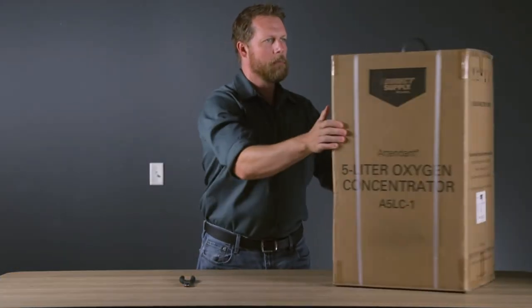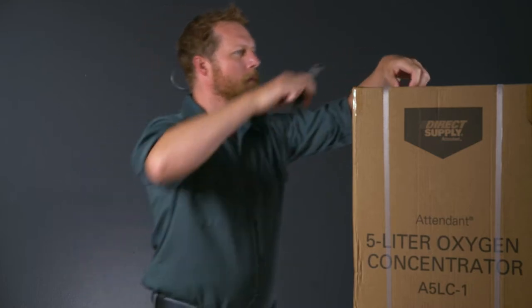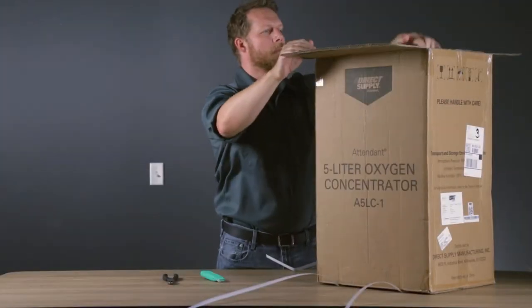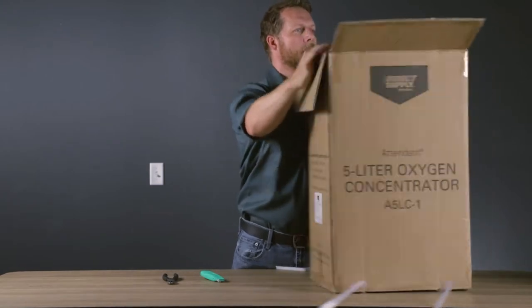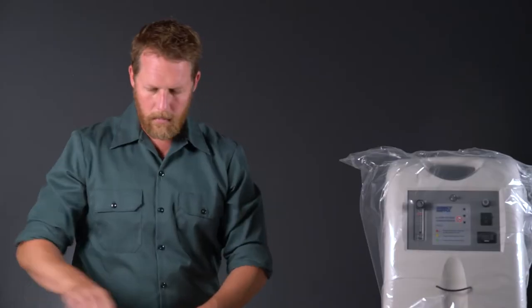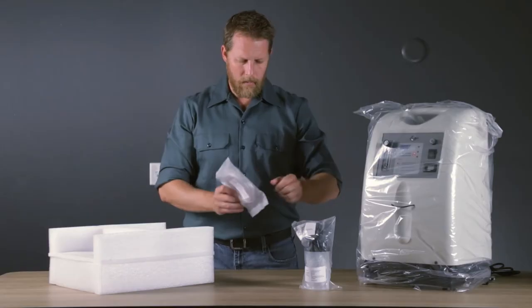When unpacking the concentrator, check for any obvious damage to the carton or its contents. If damage to the concentrator is evident, notify your Direct Supply Account Manager. Remove all loose packing from the carton, then carefully remove all the components of the device. Inspect all accessories for damage as well.